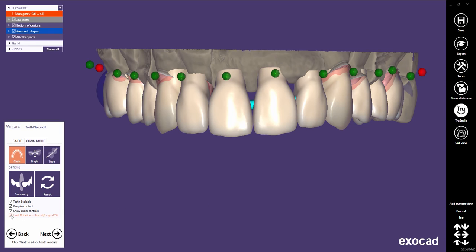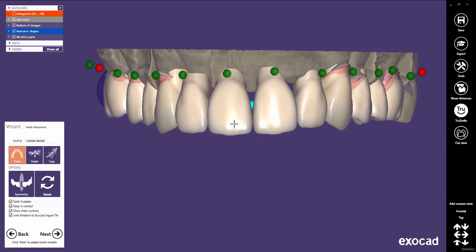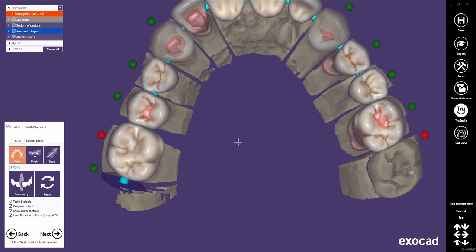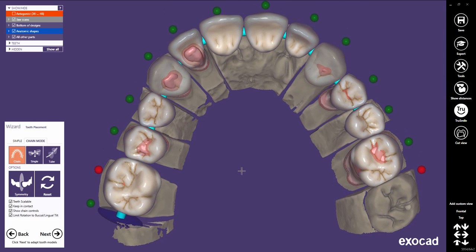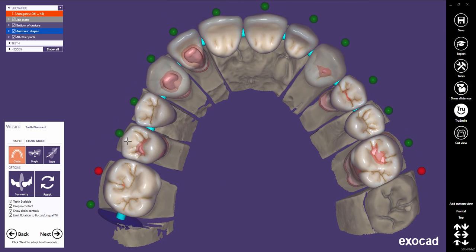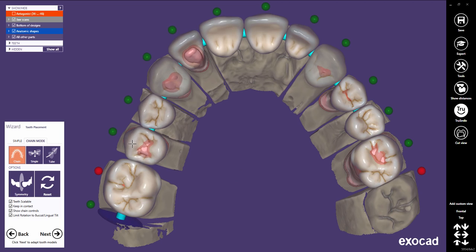Rotation actions can be limited to the buccal-lingual direction. Generally, when rotating a tooth, only the buccal-lingual tilt will influence the adjacent rotation movements.